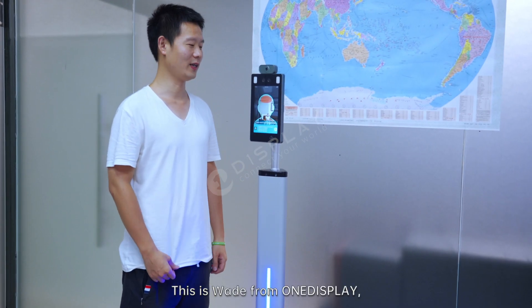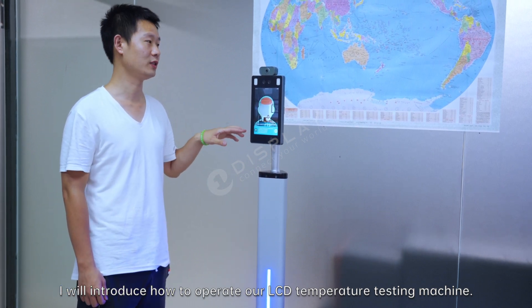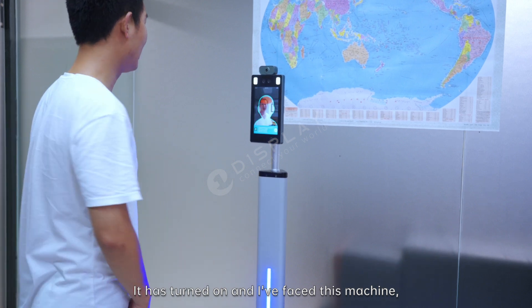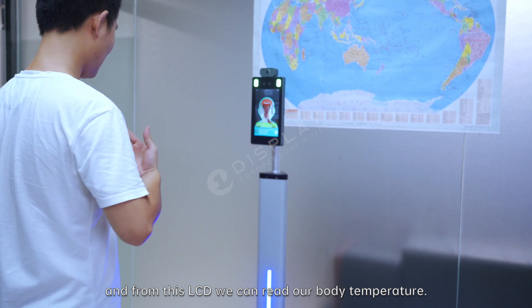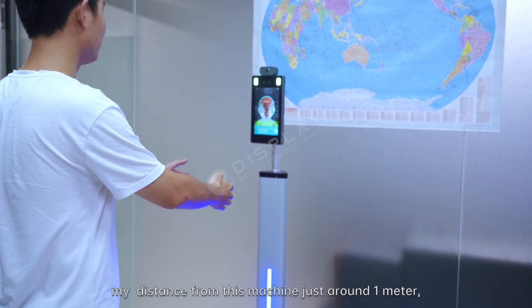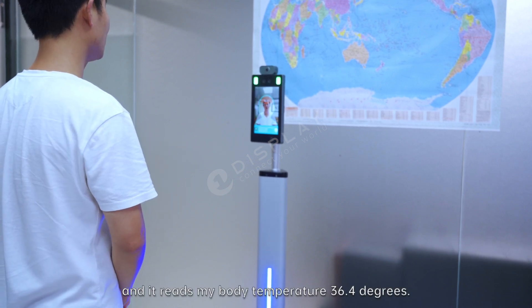This is the way from one display. I will introduce how to operate our LCD temperature testing machine. It has turned on and I will face this machine. from this LCD we can read our body temperature — my distance from this machine is just about 1 meter. Here it reads my temperature: 36.4 degrees.